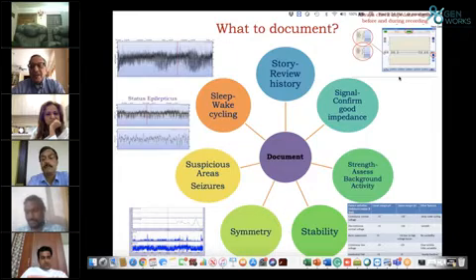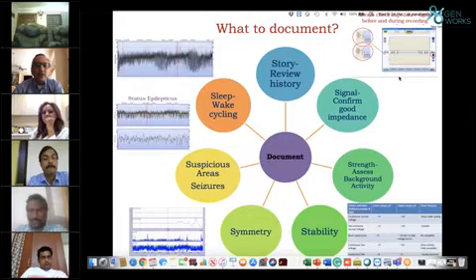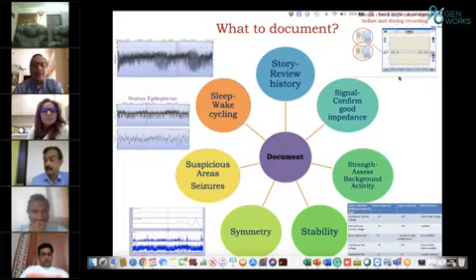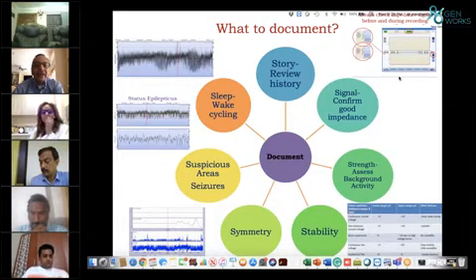And what is the stability and symmetry of the trace? Is the trace quality good? Is the signal symmetric? On the left lower corner, you can see the two channels look very different in tracing, with very low voltage on the left side, with the right side showing some variability with discontinuous pattern and some cyclicity. So you can actually interpret unilateral injury.